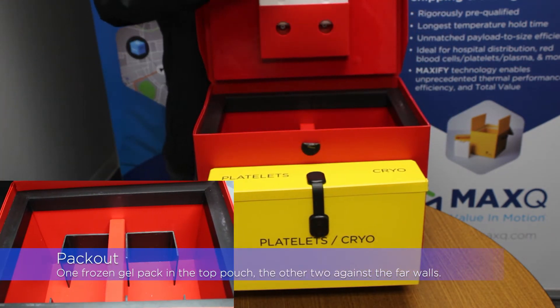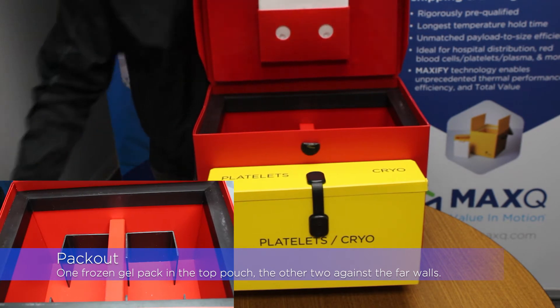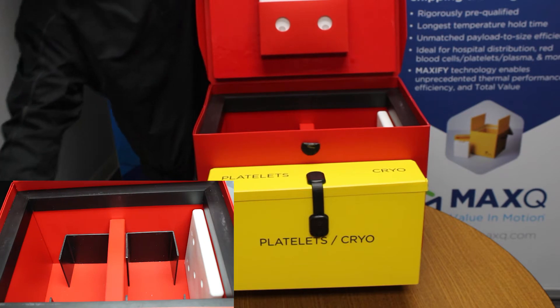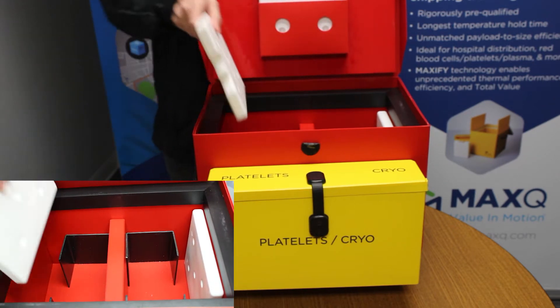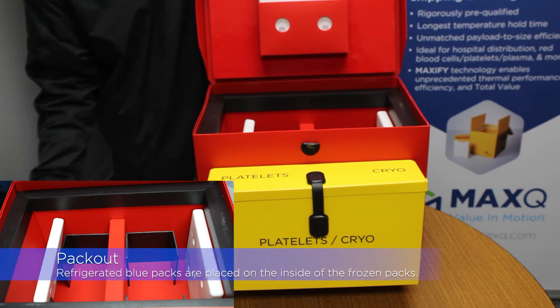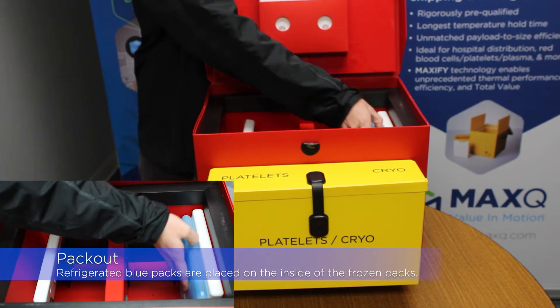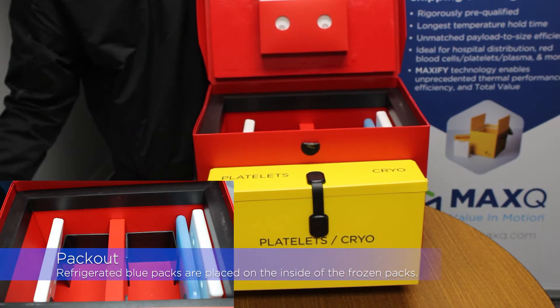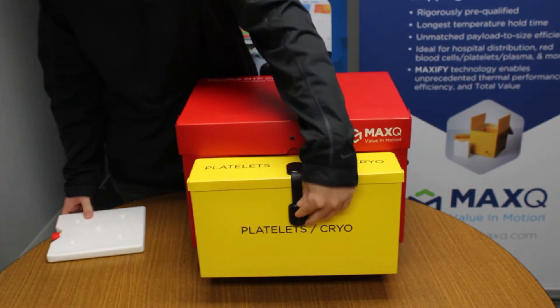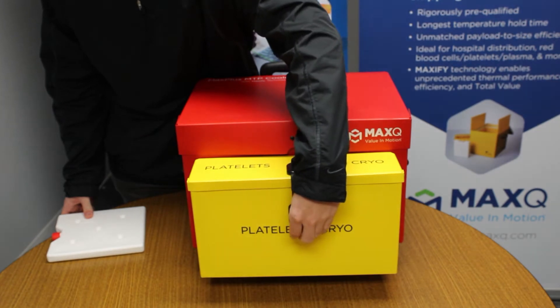Place one frozen gel pack into the slot on the lid and the other two against the far sidewalls. Next, place one refrigerated gel pack on the inside of each frozen gel pack. Finally, place the platelet gel pack inside of the platelet pouch.